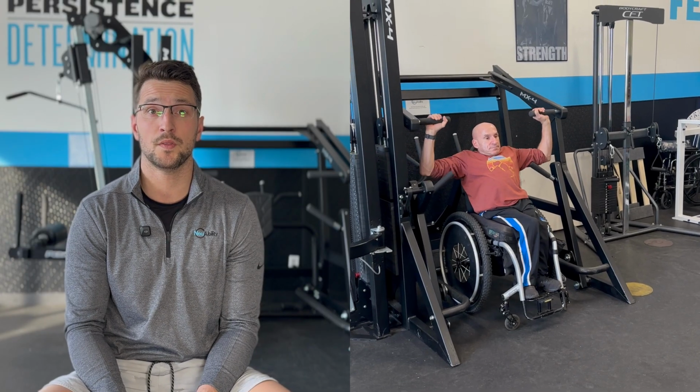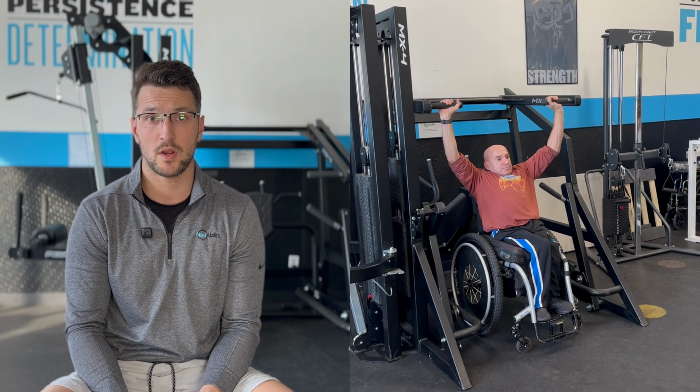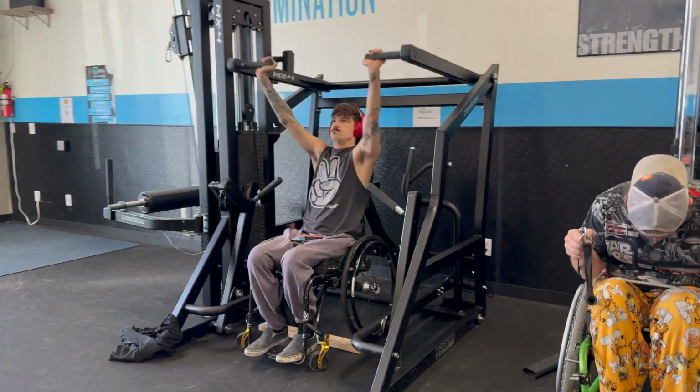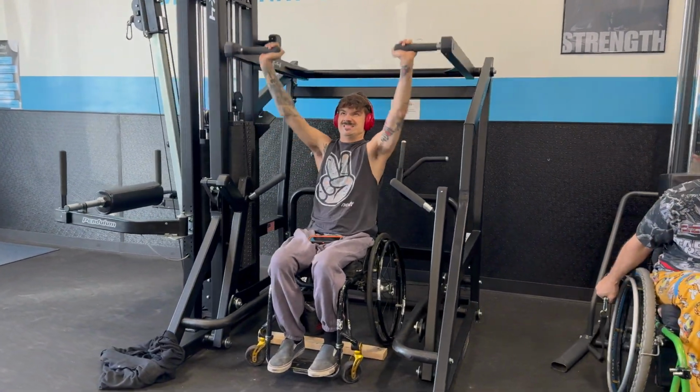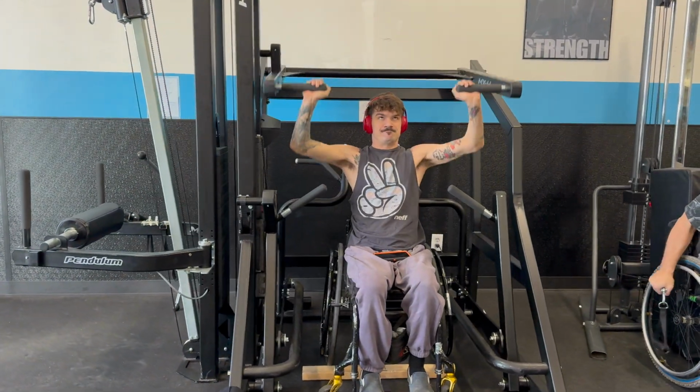Another exercise it has is the shoulder press, very similar to the chest press. You basically sit in the exact same position as the chest press, but move your hands to an overhead pressing motion. And same as the chest press, those bars also move in and out as needed, so that individuals can do a closer grip or a wider grip for the shoulder press.